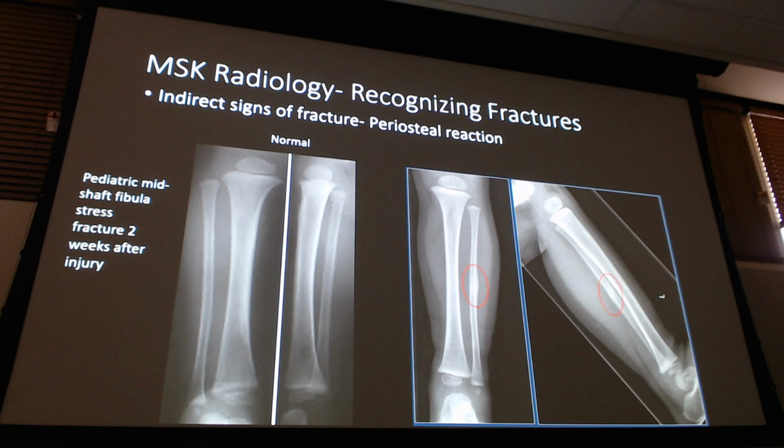Here's some periosteal reaction. This is what I was talking about here, right? So, got your normal again, pediatric or adult? Yeah, it says it right there, pediatric. But look, epiphyses, snowflakes. But primarily, I don't really see a fracture. Like this is two different legs, right? Because you always compare with kids, you always get bilateral just because you want to compare. But I don't really see a fracture in this fibula.